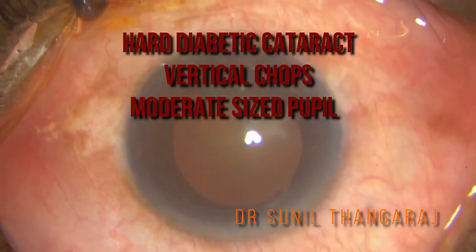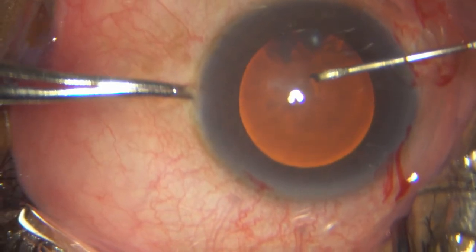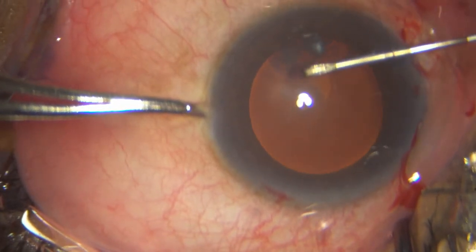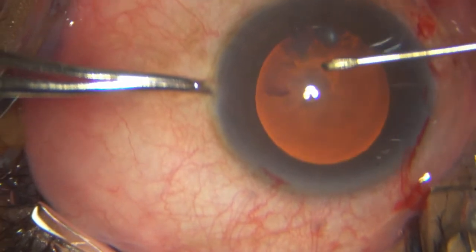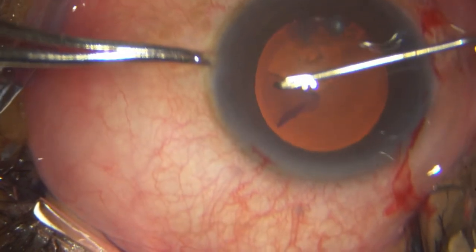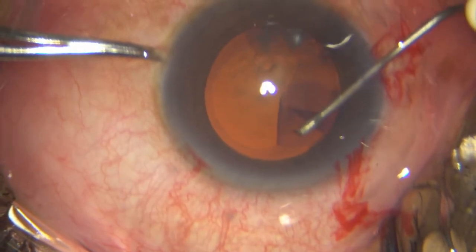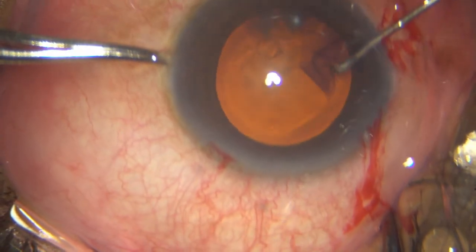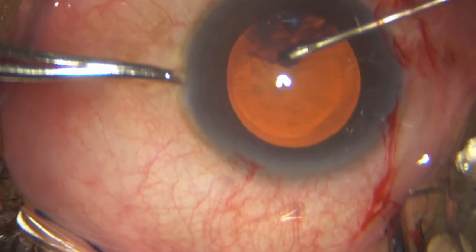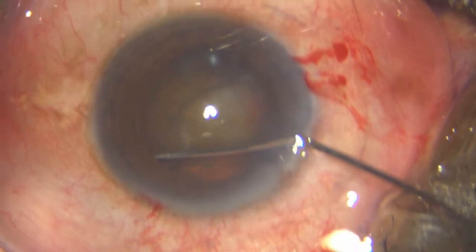This is a relatively hard cataract with a moderately dilated pupil in a diabetic. I am putting in my 2.8 millimeter incision, and after dyeing the capsule with trypan blue, I go ahead and under HPMC I am performing my capsulorrhexis with a 26 gauge needle, just trying to hug the pupil as much as possible and ensuring I get an adequate rhexis — around a 5.5mm, probably a 5mm rhexis in this case, which is a little bit on the smaller side.